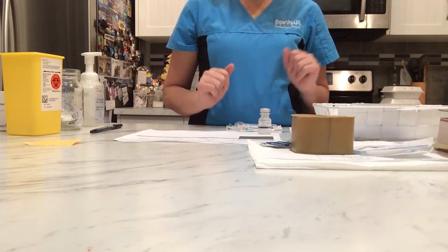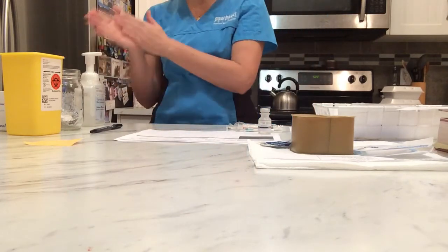Okay, now that I have everything ready, I will do one more time my hand hygiene, and I'm gonna bring an alcohol swab. I'll scrub the vial for 30 seconds.